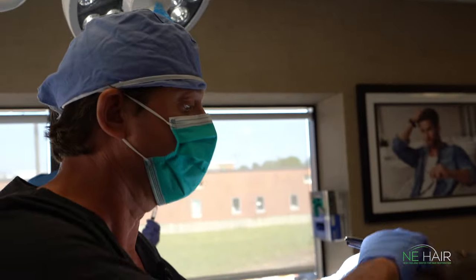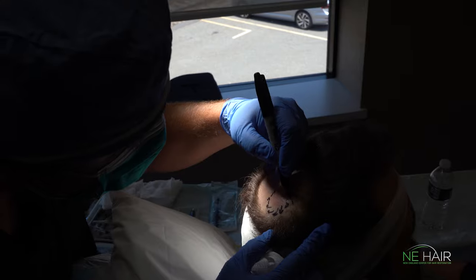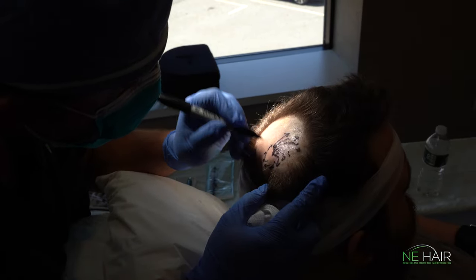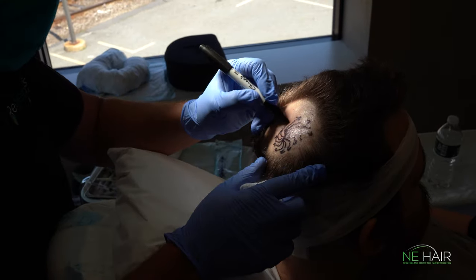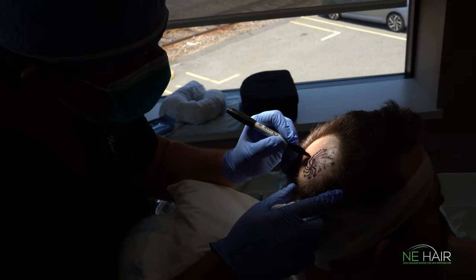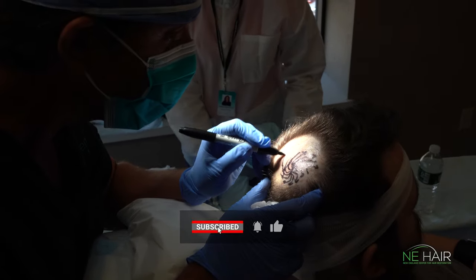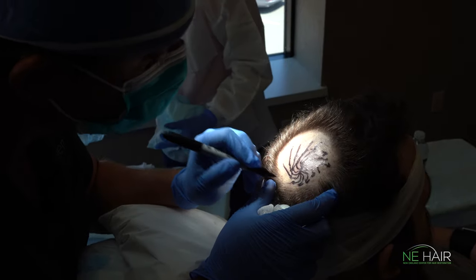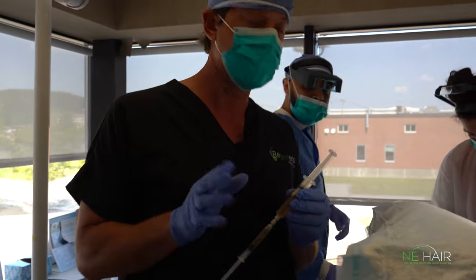The reason I'm going to draw is because there was a whirl here before, so we're going to try to find that. Everyone has a whirl in the back of their head, and we just want to recreate that — follow what's existing and try to get it so the hair starts going out the way it naturally does. We already have some platelet-rich plasma made that we're going to inject in the graft site as soon as we make the sites.